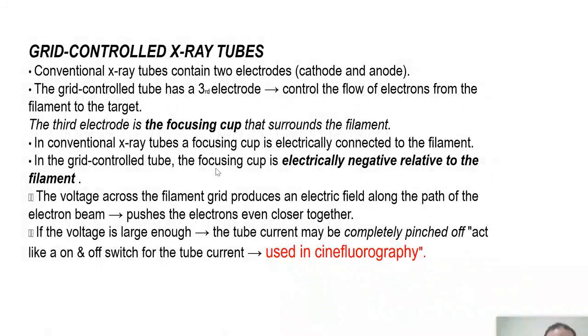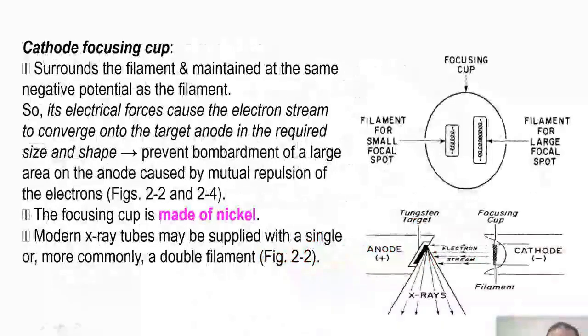Once, and then, for example, there is a frame, or there is something between the first and the second, right? It seems continuous, but there is a difference between each image and the next, especially in cases of fluorography. There is indeed a difference, but it is a small difference. To achieve the strength of the X-ray beam that gives you this effect, what you do is connect the focusing cup to a high negative potential.